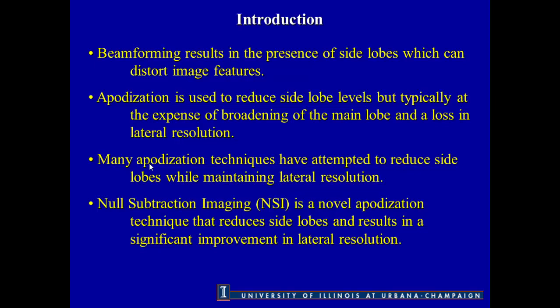So in this particular work, we just wanted to try and adapt that technique to see if we could use this for ultrasound imaging and improve maybe some lateral resolution and other things by imaging with the nulls. And we call this technique Null Subtraction Imaging. And hopefully it'll reduce side lobes, but at the same time, give us a boost in lateral resolution. And maybe for particular tasks, it might be useful. For others in diagnostics, it might not. So we're just going to examine a few of those today.